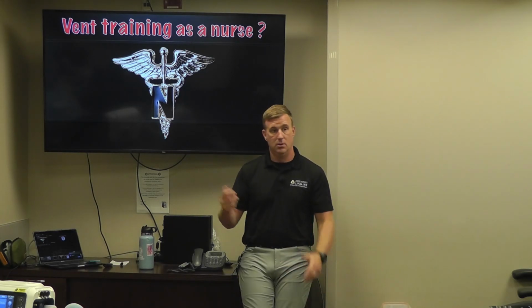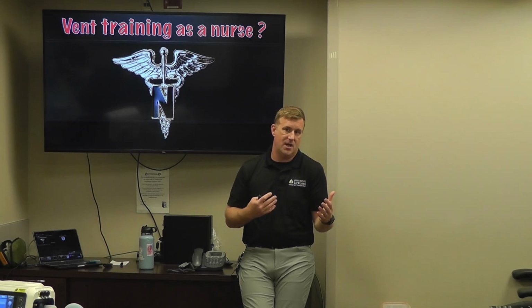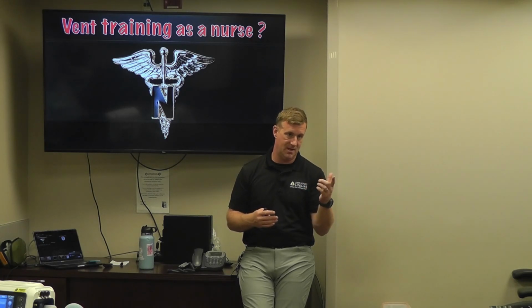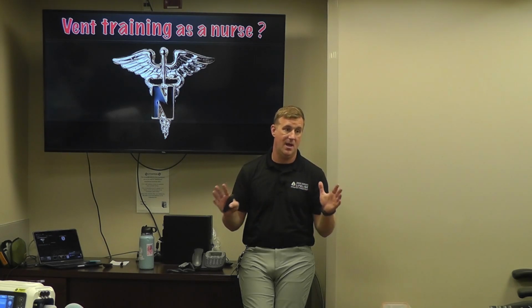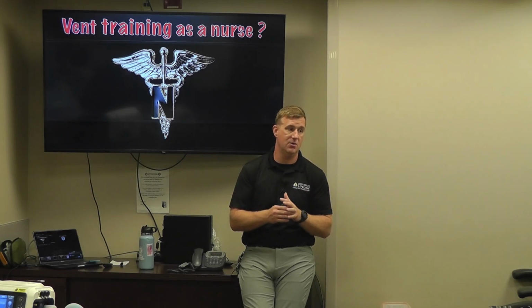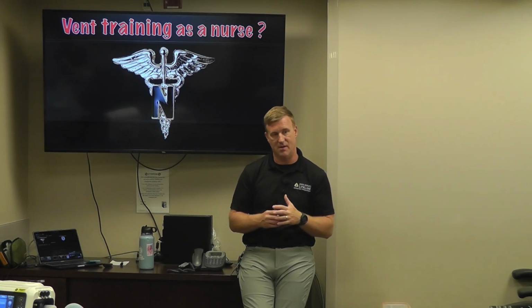Okay, so for our sole nurse in the room, and I'm a nurse as well, what ventilator education did you get during nursing school? Yeah, right? There's the oxygen enrichment button, there's the silence button, anything else call respiratory therapy. Really during nursing school you get nothing, and then when you get into the unit or the ED there's the oxygen enrichment button if you want to take them to 100% oxygen, and there's the silence button, right?